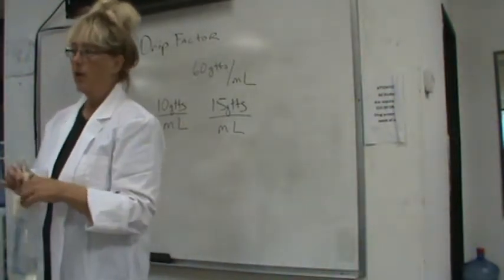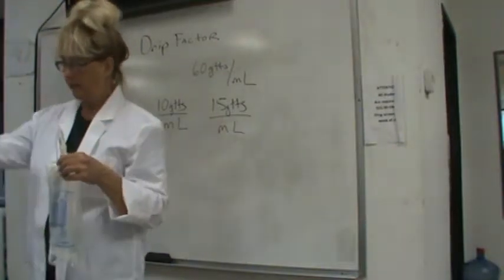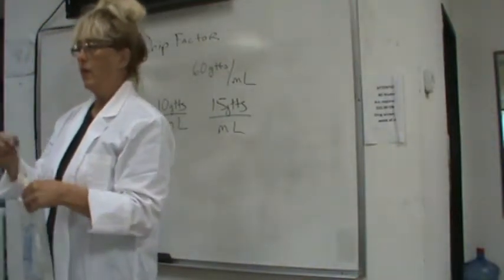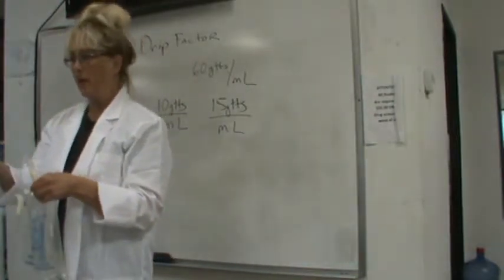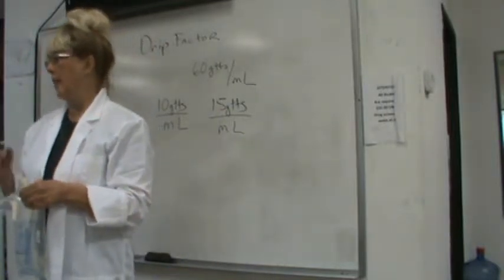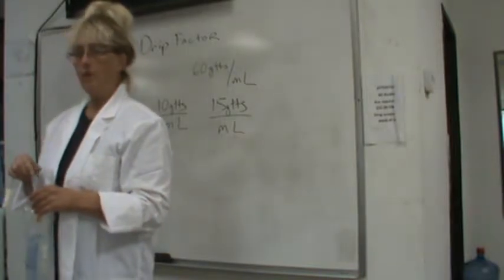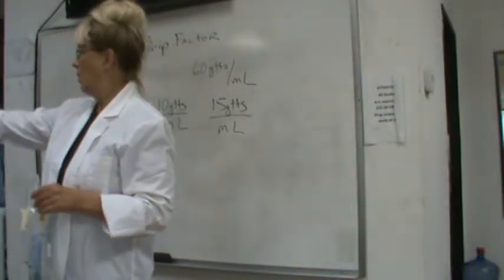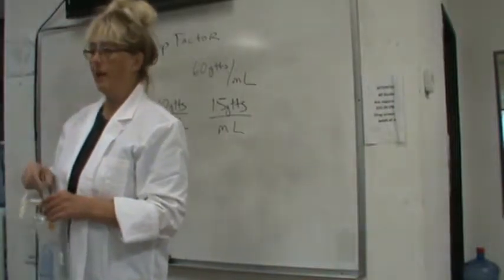Okay. So once you get your chuck pad in front of you, do you have an IV bag, Georgia? No. Raina, could you hand her a normal saline bag, please? None of you have IV bags then? All right, let's get some IV bags. In that one box, grab an IV bag for each of you, a small IV bag.